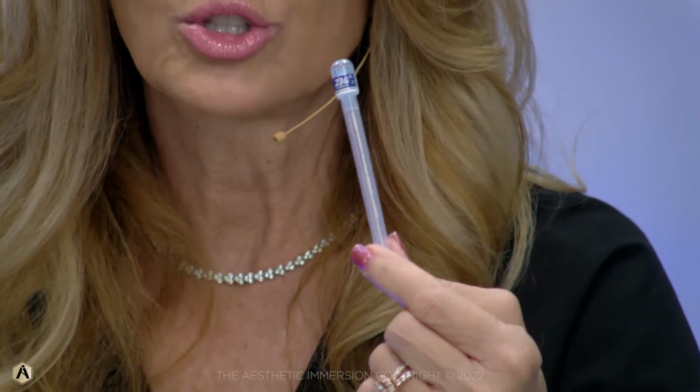We all know a 22 is kind of a garden hose and a 25 is too small. So I figured a 23 would be in between, and it truly is. The product flows well from it. It glides through the skin like a 25, but it's a little bigger, so it gives me a little bit more safety. But on cannulas, please remember, be gentle, be thoughtful. Let the tissue let you in. Don't ever force it. If it stops you, then back out and go in a slightly different direction and let the tissue let you in, which is the safest thing.